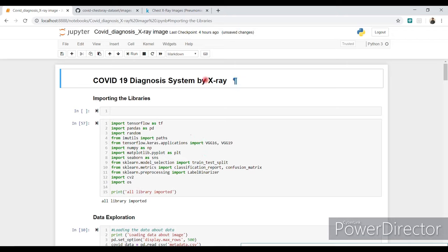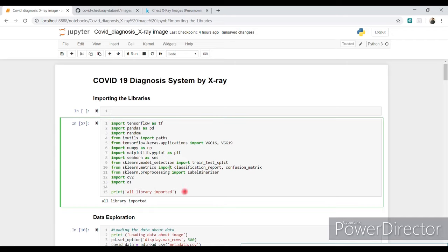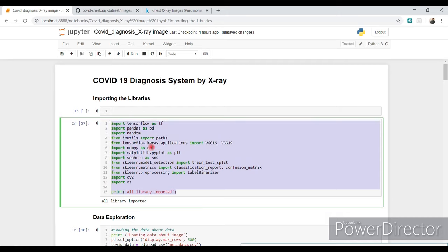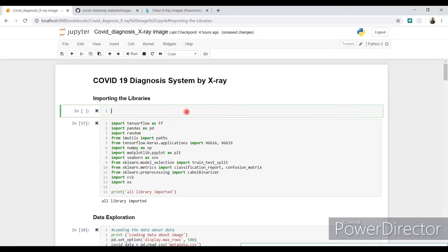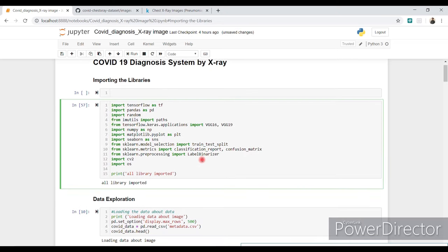First of all, these are the libraries that we have to install in Python. If you have any kind of error like 'no module named cv2', 'no module named OS', or 'no module named tensorflow', then just write the command 'pip install' followed by whatever the module name is. If you still have an error, mention it in the comment section.